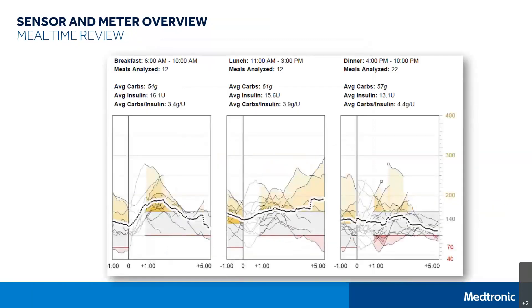Next, we will move on to the meal summaries. You will need to be using the bolus wizard feature to generate data in this section, and the times can be customized for each meal. The start of the meal will be marked as zero and extend by however many hours you have set for the meal period — in the breakfast chart here, the meal window is set for five hours. Pay attention to high and low patterns after meals. It's recommended that you rise 30 to 60 milligrams per deciliter post-meal. If you are dropping within two hours after a meal, like the dinner example on the screen, your carb ratio may need to be adjusted. If you notice this, please report it to your healthcare provider.